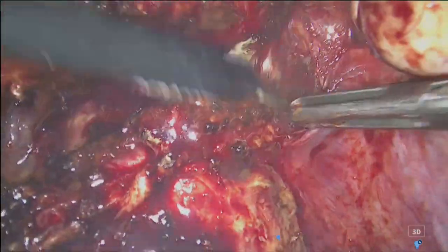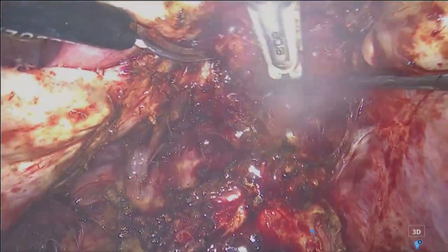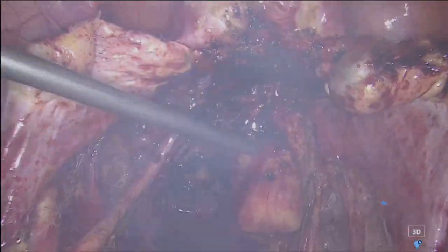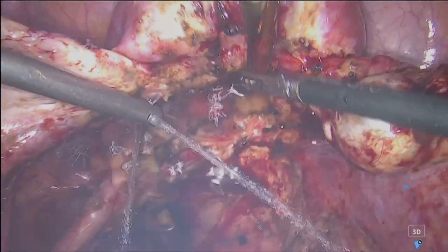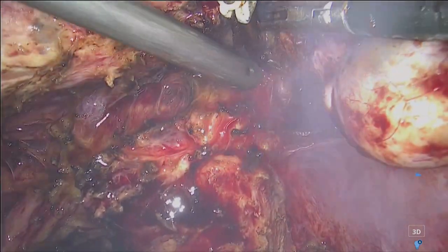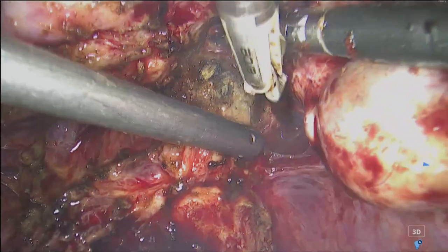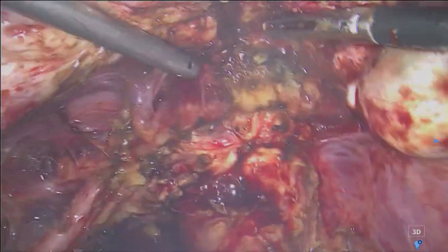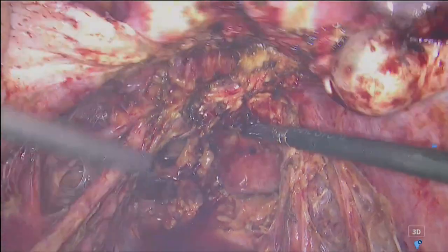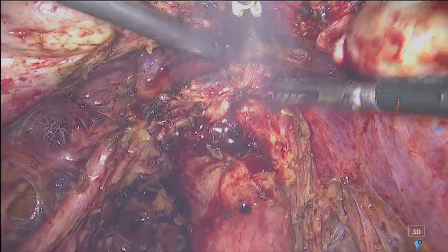Another very, very important, probably the most important preoperative ultrasound evaluation is to identify the retrocervical nodule and separate it from the real infiltration of the rectum. This is very important in order to give the surgeon the correct infiltration of the disease. If you consider all the sites from here to the infiltration of the inner part of the rectum, you can overestimate the sites of the nodule.